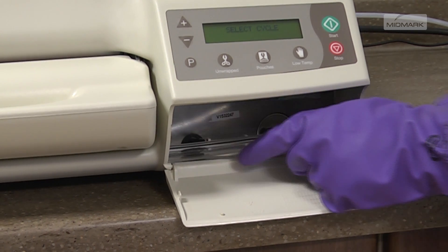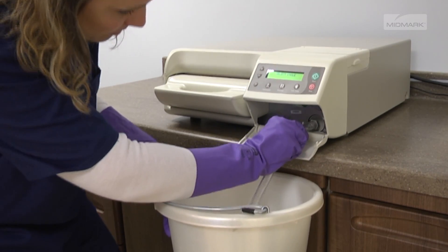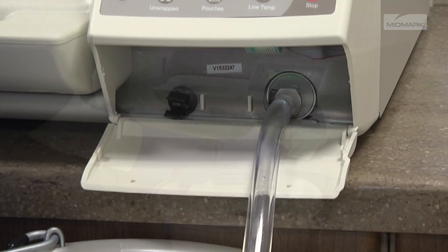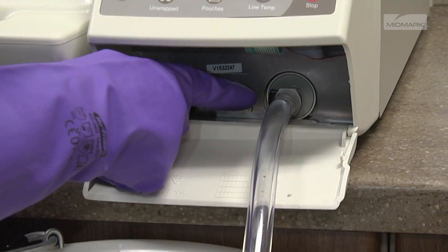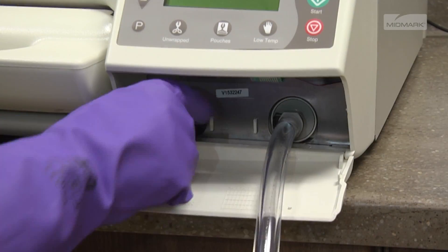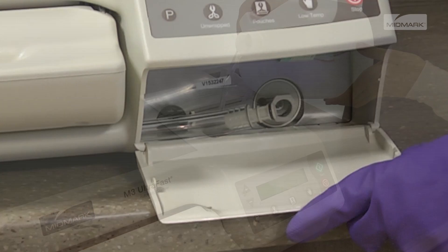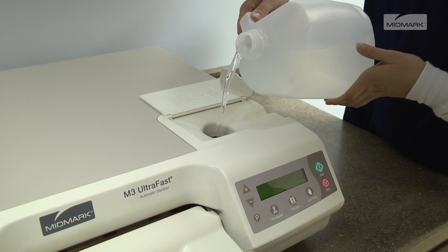Remove the drain hose from the storage location and place the open end of the drain hose into a container or sink. Connect the adapter end of the drain hose to the coupling as shown. Once the water has been drained, press the release lever and remove the hose. Return the drain hose to the storage location and refill the reservoir with distilled water.